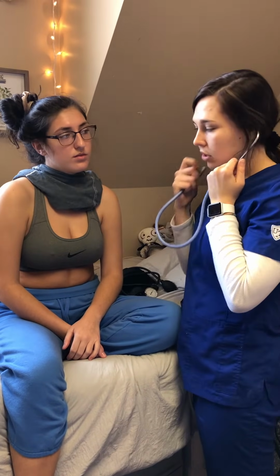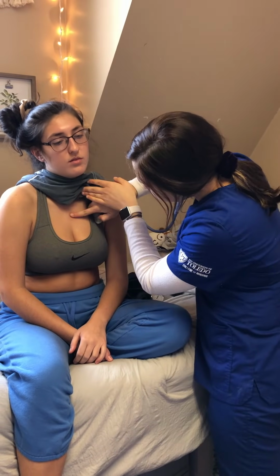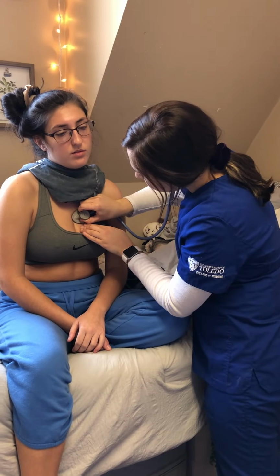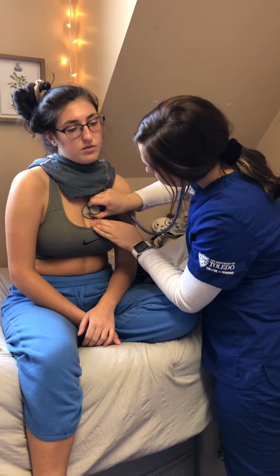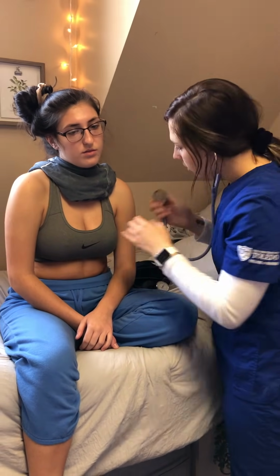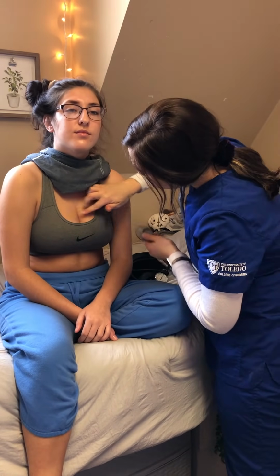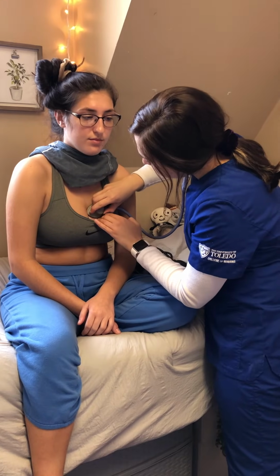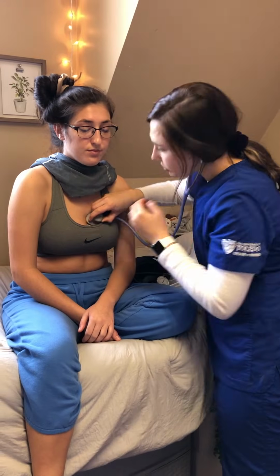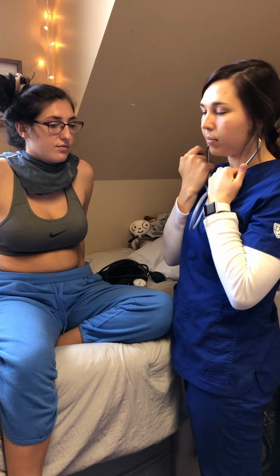And now Erb's point, which is the third left intercostal space. And now the tricuspid, which is the fourth left intercostal space. And then ending with the mitral, which is the fifth left intercostal space, mid-clavicular line.